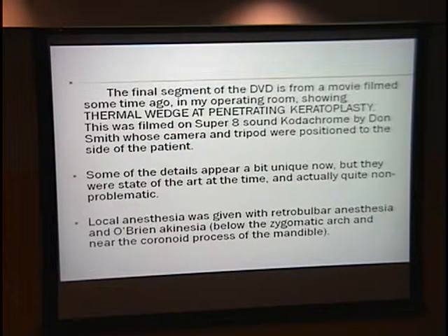The final segment of the DVD is from a movie film some time ago in my operating room, showing thermal wedge at penetrating keratoplasty. This was filmed on Super 8 Kodachrome sound film by Don Smith, a friend of mine whose camera and tripod were positioned to the side of the patient. There was no through-the-lens viewing with the video camera at that time. Some of the details appear a bit unique to you, so I'm going to tell you about some of the things you see so you won't just be stunned by seeing them, but they were common at the time.